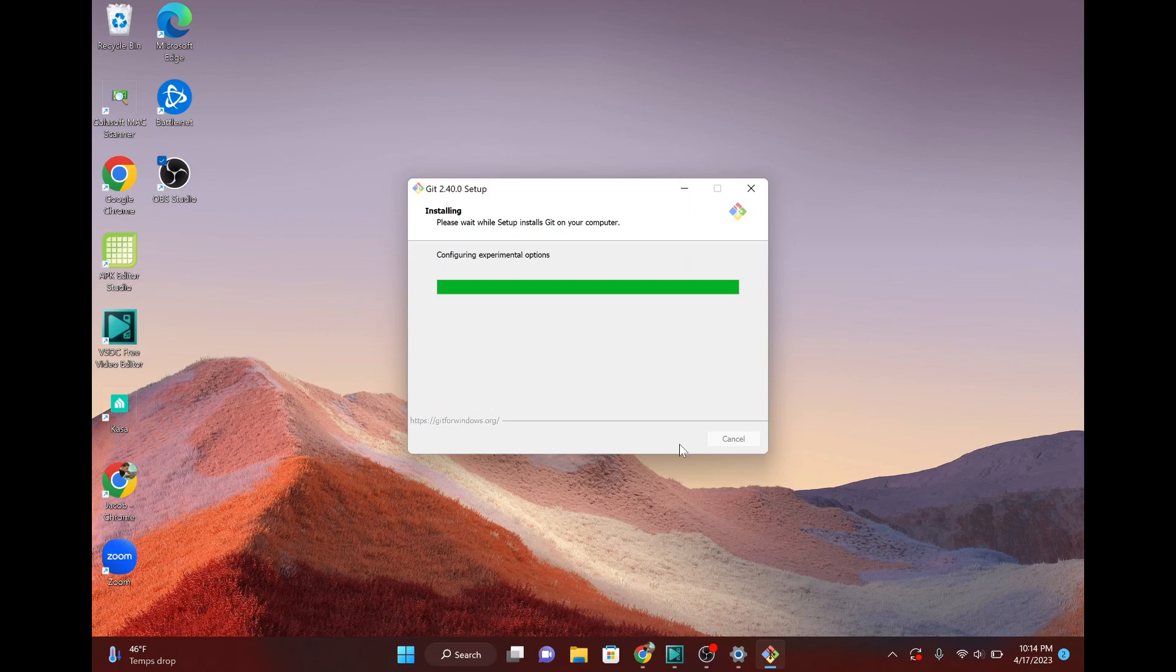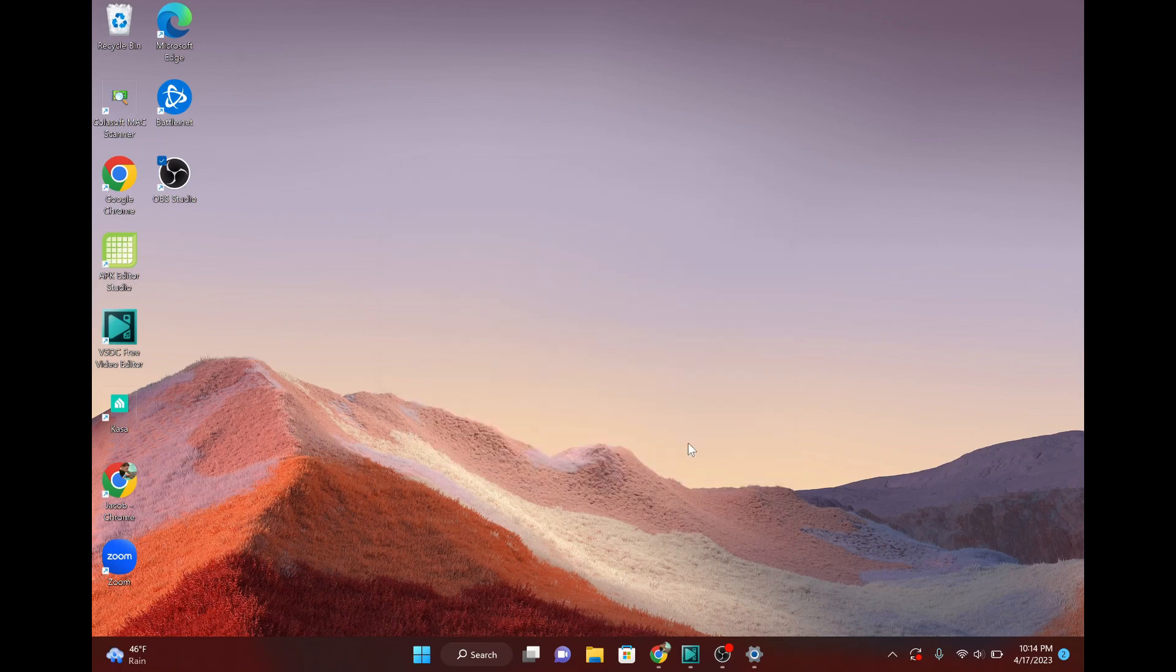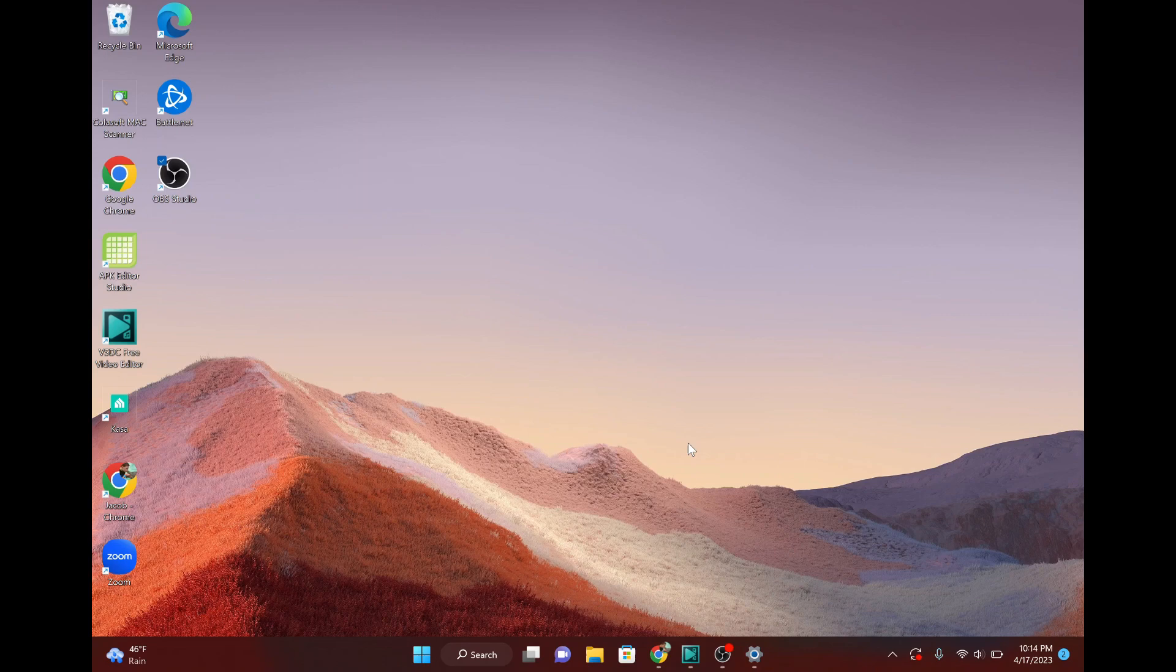So once it's finished doing all that, you don't need to view the release notes or you can launch it. Just hit finish. Basically, you just need that app there running in the background. So now we're going to do the same thing with Android Studio. And again, do this after Git has finished installing.